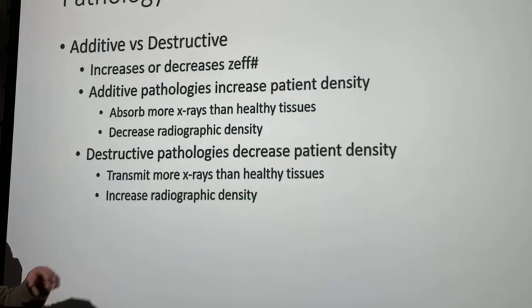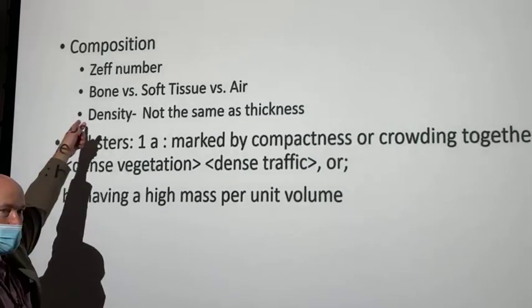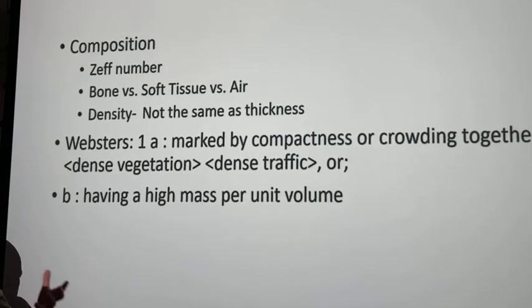So back to that. You're looking at an x-ray image. Bone. How does bone appear on the image? Very clear, it's a light density, right? So how is it inside of the patient's body? Is it more dense or less dense inside of the patient's body? It's more dense.